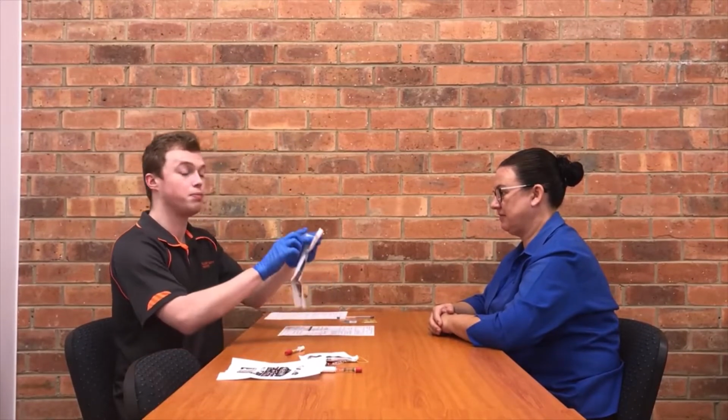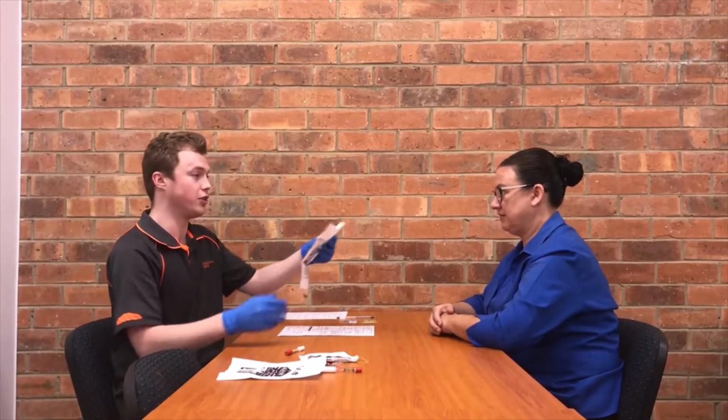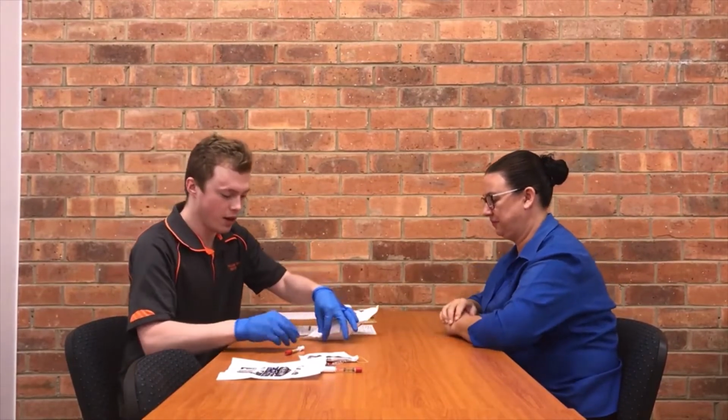Alrighty, so we've got the bag here. We'll instruct the donor to blow into this mouthpiece here. So 1 long continuous breath, nothing too crazy. Keep going. Yep, stop. Perfect. Wonderful. So as you can see, it inflates quite quickly.